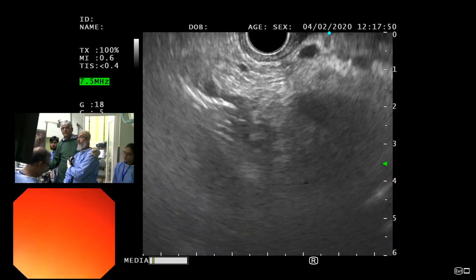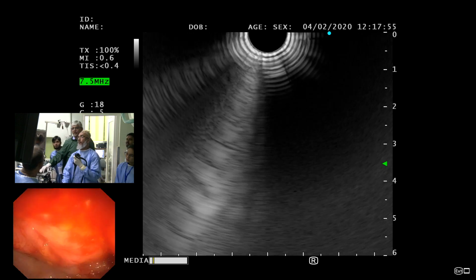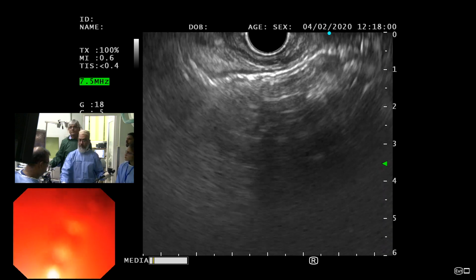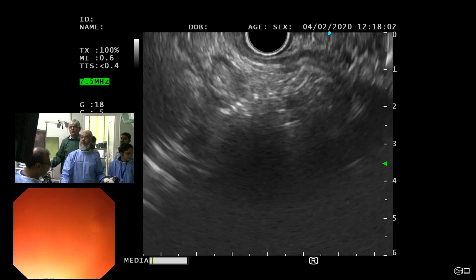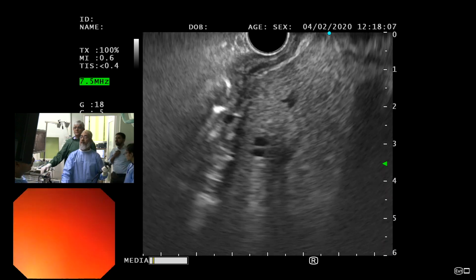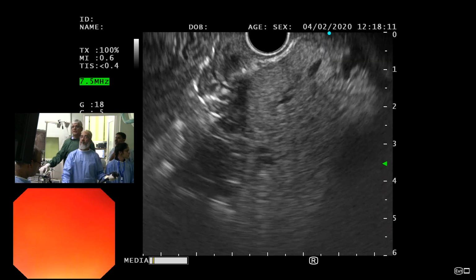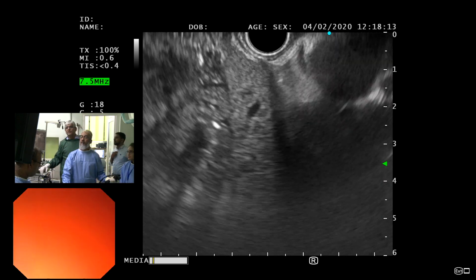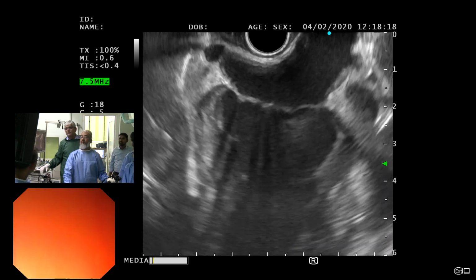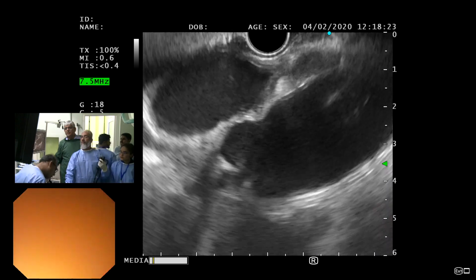Just come back to the mediastinum. Our sample is very good. Okay, nice, wonderful. 5 centimeter core. Wonderful. That's brilliant. So let's see what that shows. What I will do is I'll make sure that we send the histology, जो हमने की है उसकी, जो हमारे पास formal report आएगी ना, we'll share it with the faculty. That's wonderful. Appreciate it. Clockwise. थोड़ा सा pull back. Yeah, keep coming.